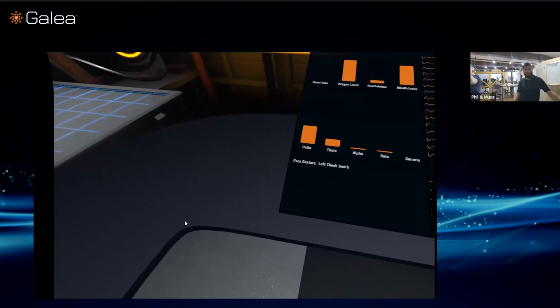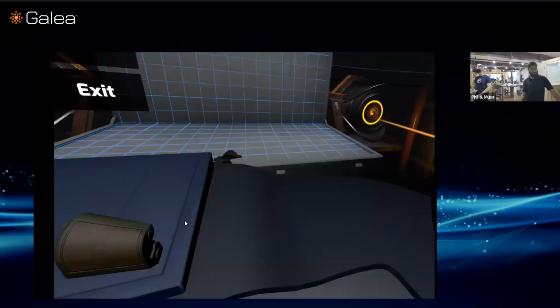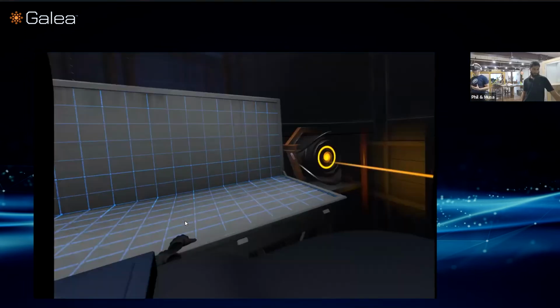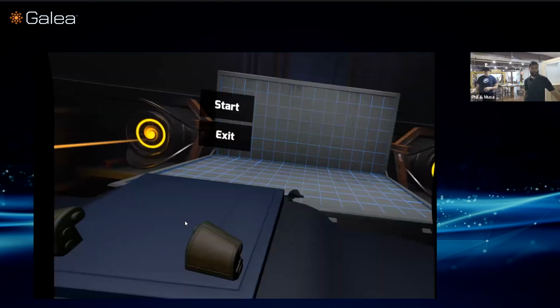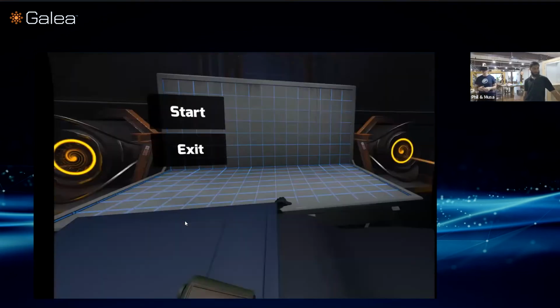Yeah, that's good. As you can see, it's very responsive, and he can pretty much do all of these commands on demand as I tell him what to do. It works pretty well just in the game environment too. And you can think of a lot of interesting applications for face gestures like this. Obviously, we showed you an example of using them as inputs in a game environment.